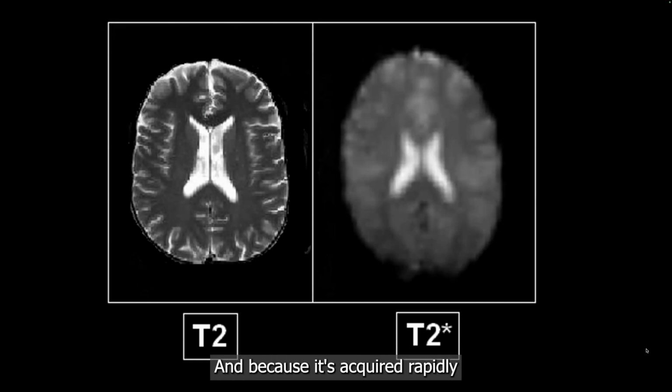And because it's acquired rapidly and it's not cleaned up in the same way, it may have information in here. At each voxel and each slice, it retains some information about blood flow. And because of that, it allows us to look across all of this space at where there's more flow and where there's less flow. So when you hear T2 star, it is a common type of BOLD fMRI imaging.